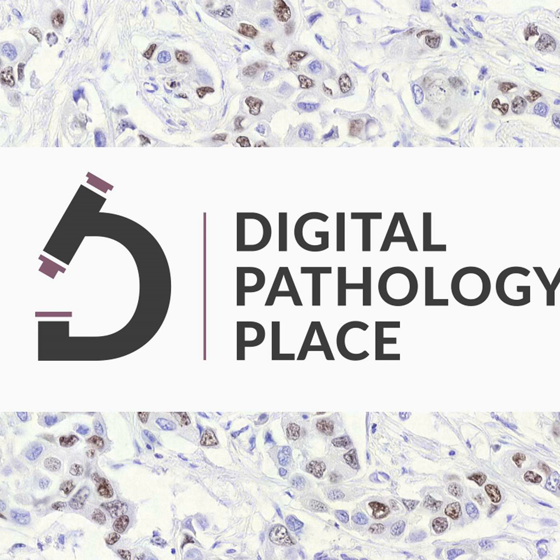The million-dollar question. It really boils down to variability at multiple levels. First, the obvious ones. Staining protocols are different everywhere. Scanners are different models with different settings. Those alone require site-specific adaptation or validation. But it's deeper than that. Much deeper. The major hurdle is the fundamental difference in hospital IT infrastructure.